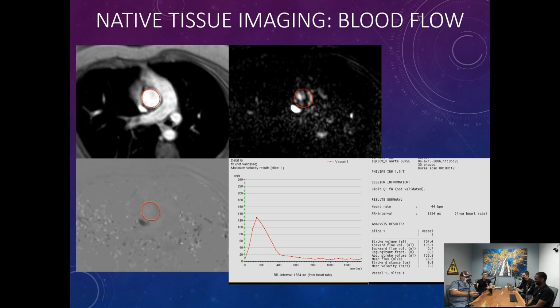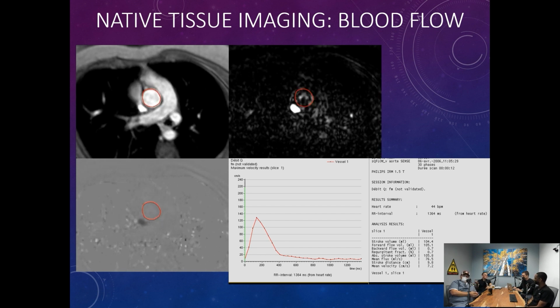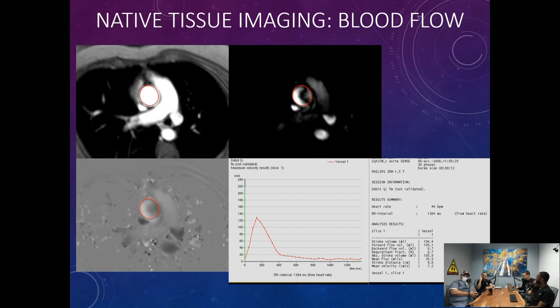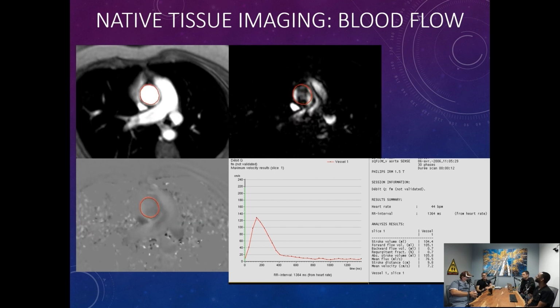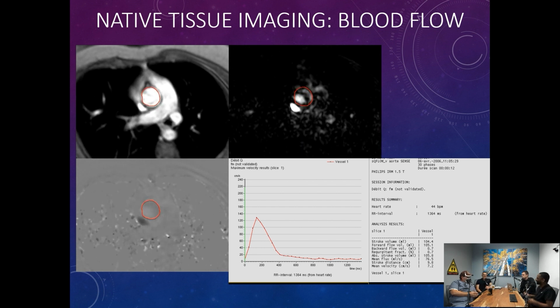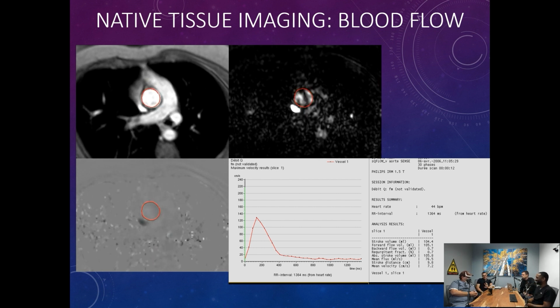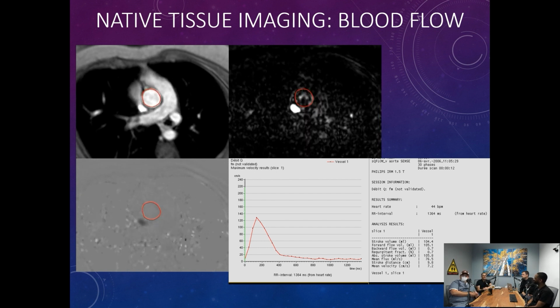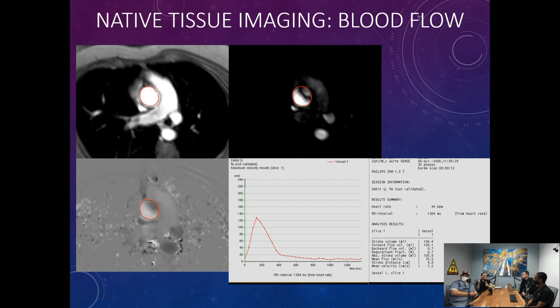And as Clint was saying, often the patient's going to have an echo or something where we can measure blood velocity. So we can ahead of time sort of say, hey, the echo got 250 on the velocity. So let's maybe do 260 or 270 so we make sure we don't alias, and so we can take like an educated guess.